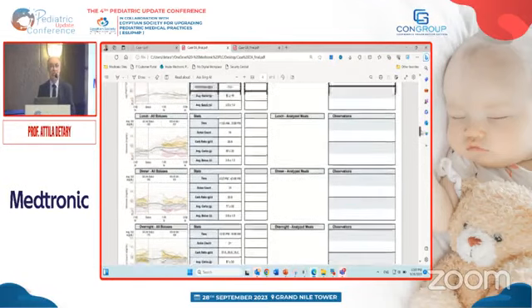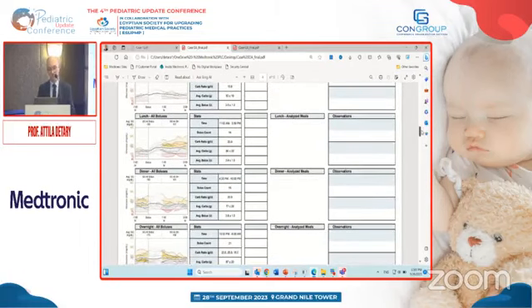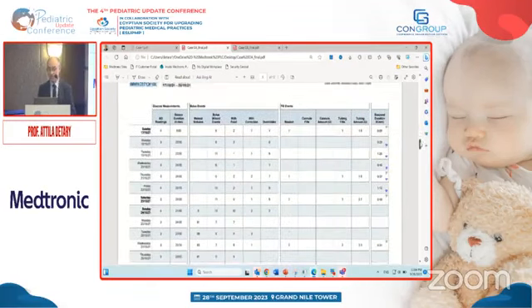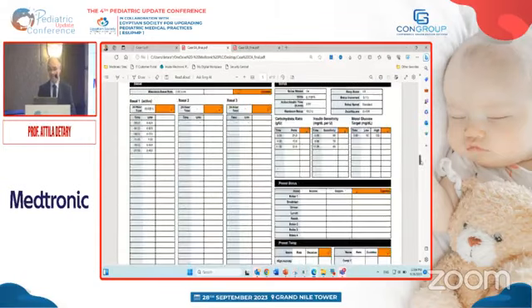Then we have the meal report. So the pre-meal and post-meal is rather good. Maybe a little bit here at lunchtime, it could be better. The patient could announce the meal a bit earlier. But generally, I think it's a very good result. And then we see how often the patient changes the infusion set and the reservoir in this report. We don't have time to cover the report.